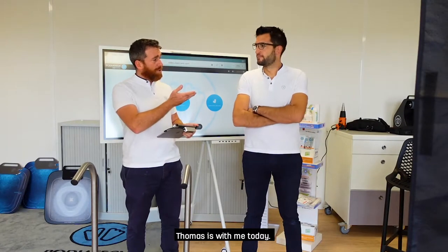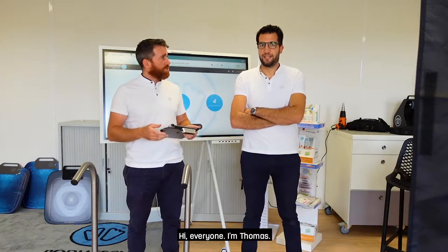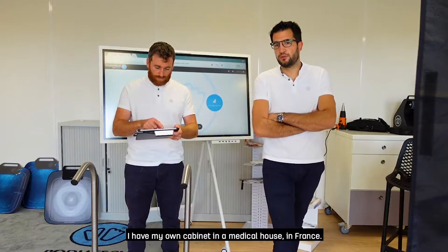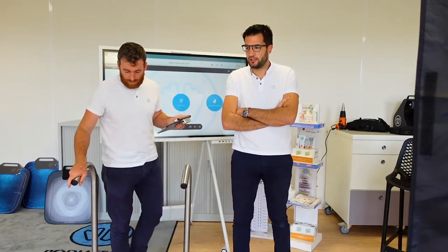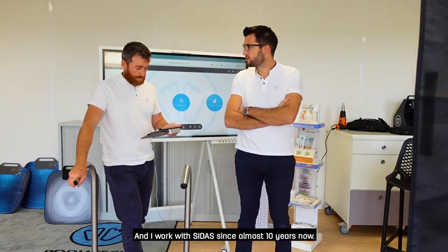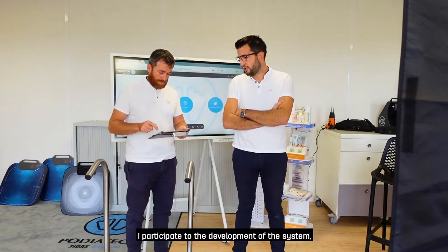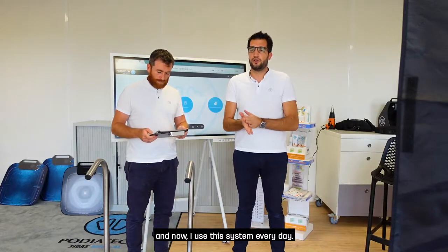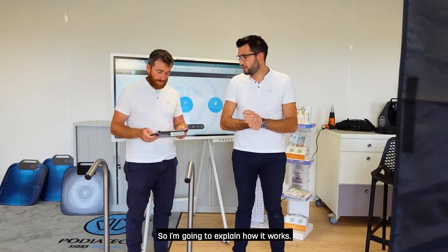Thomas is with me today. Hi everyone. I have my own cabinet in the medical house in France and I work with SIDAS since almost 10 years now. I participated in the development of the system and now I use it every day, so I'm going to explain how it works basically.